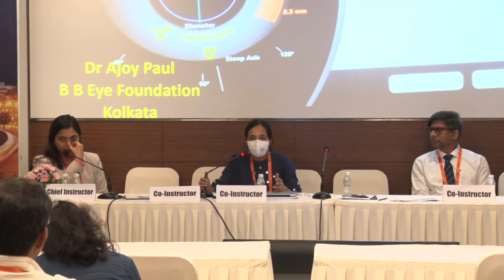So I think for most, 90% or 95% of cases, we don't need to worry about measured PCA today, at least, with the level of technology. Not everybody is actually measuring. Yeah. So it's a lot of assumption on both sides.